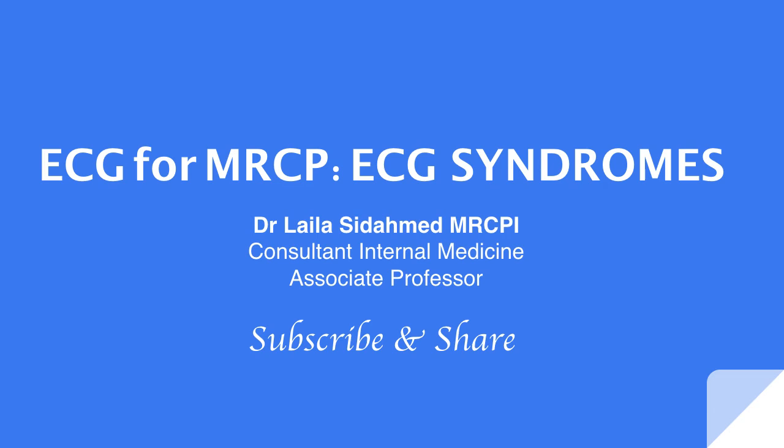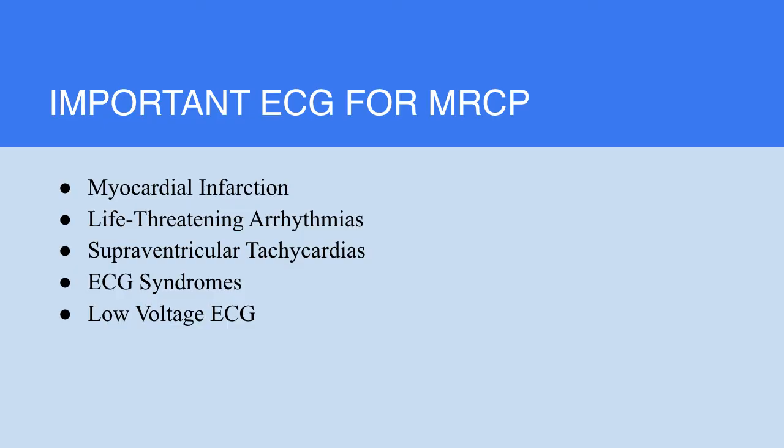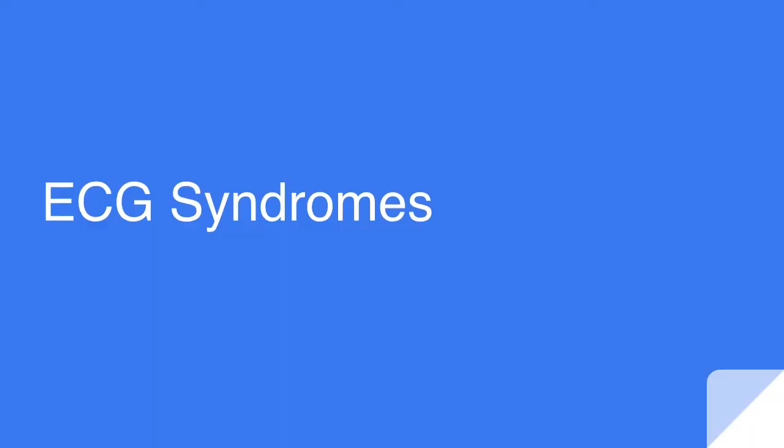You are most welcome for the topic of tonight, which should be on ECG for MRCP, and we would be tackling the ECG syndromes. Those are the topics we are intending to cover. Myocardial infarction covered already, life-threatening arrhythmias already done. This time I would be covering the ECG syndromes and then followed by the supraventricular tachycardia, because most of the ECG syndromes, actually two of them, would lead to supraventricular tachycardias. So here we are, let's start.